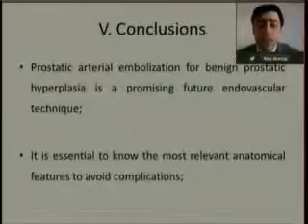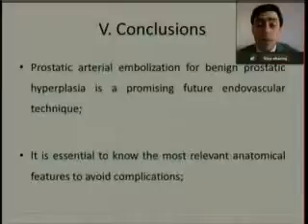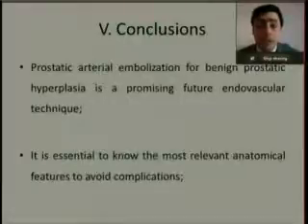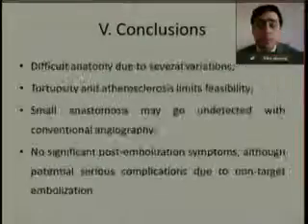So in conclusion, it's a promising future endovascular technique. It's minimally invasive and can have a place in the guidelines as a minimally invasive procedure. It is essential to know not only what is BPH and the clinical characteristics of the disease, but also to study the prostatic anatomy. The vascular anatomy of the prostate is very important to embolize the prostate. Next.